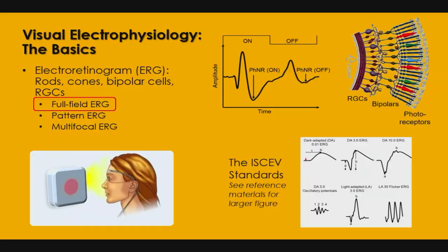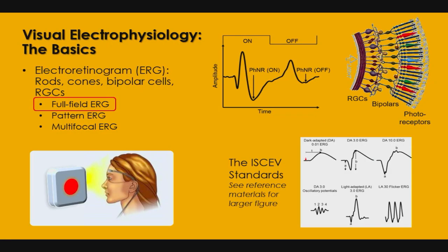Why is one of my diagrams missing? Great. The other thing about electrophysiology is that we can vary parameters of the stimulus and we get different signals. So if the light flash, we call it the duration, so if the duration of the flash is very short, you would get a short signal. You get just this part, okay?